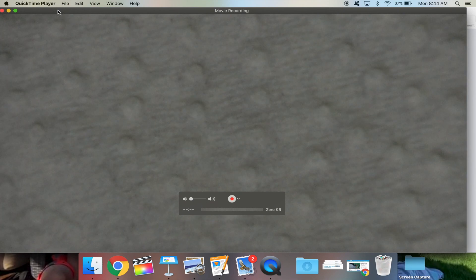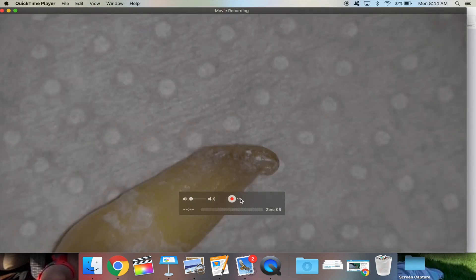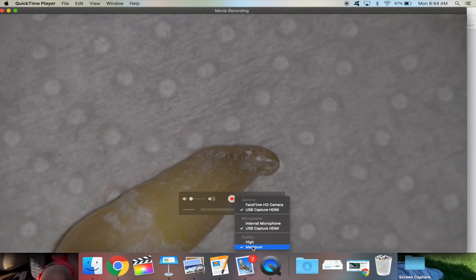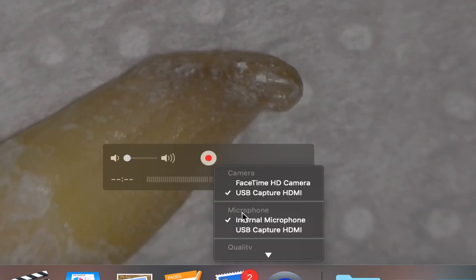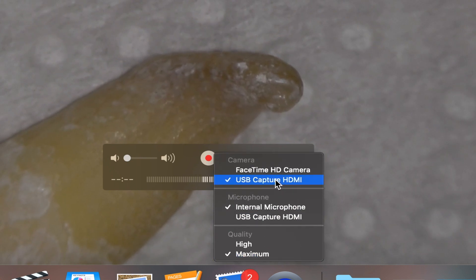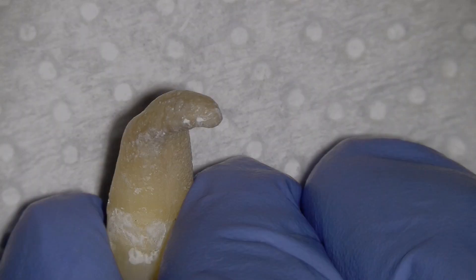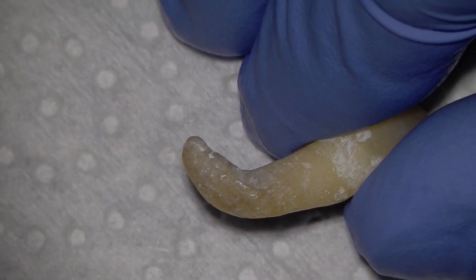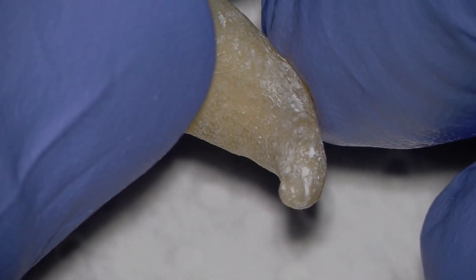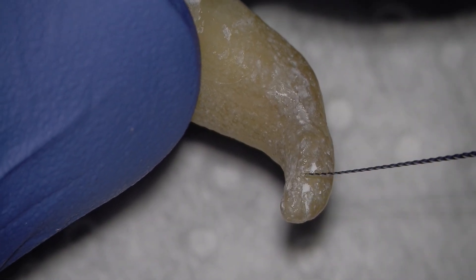I open up QuickTime, click on new movie recording, and now I can see the screen — it's as simple as that. I make sure all my settings are correct, select my QUSB capture device, and hit record. Now I'm recording all of this footage as you're watching it. If I need to rotate the image, I just rotate the camera in the beam splitter.